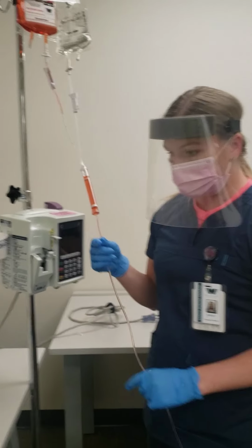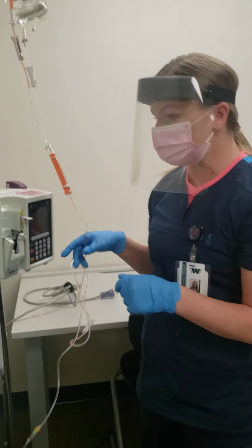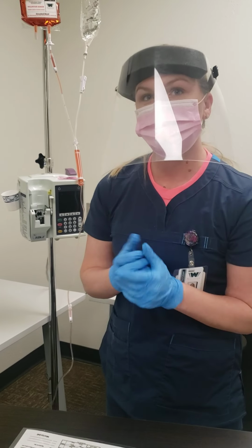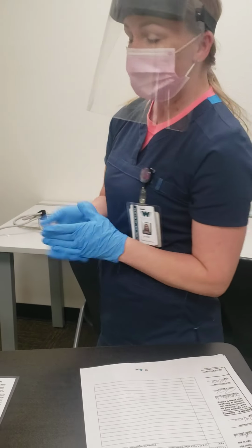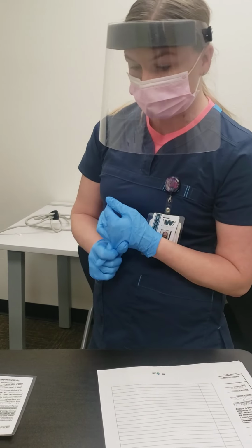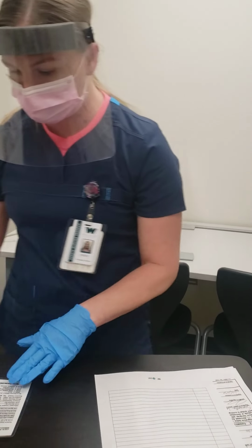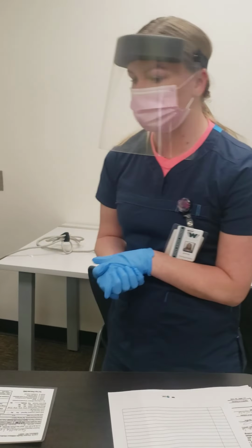So to throw this away, I would just put it in a bio bag, and I would document the blood type. I would also note the time and make sure to call the lab so that they can get the H&H in an hour, so that they're aware of that time. And then I would document the type of blood, Samantha's reaction, all the components that are on this form, and that is it.